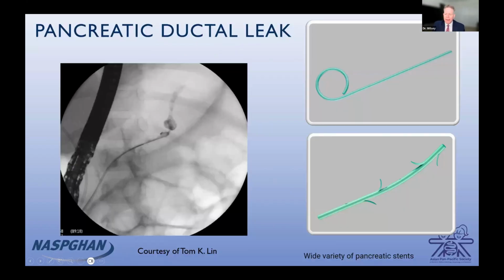And so what else is ERCP useful for? Well, you can put a stent. So patients who crack their pancreas, right? Handlebar injury, motor vehicle accident, trauma. I had a little one, two boys who got into a construction site and they were playing Marvel superheroes, jumping. And one kid jumped onto a front loader and cracked his pancreas.